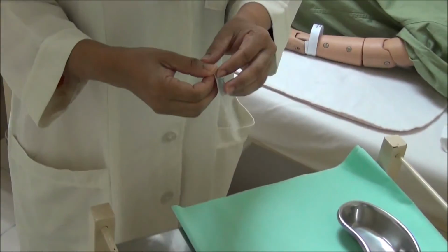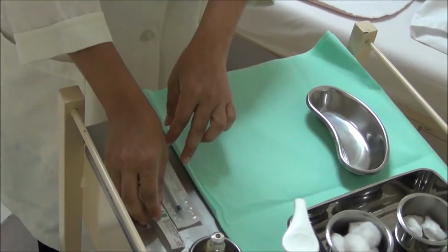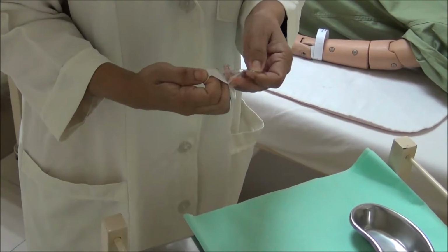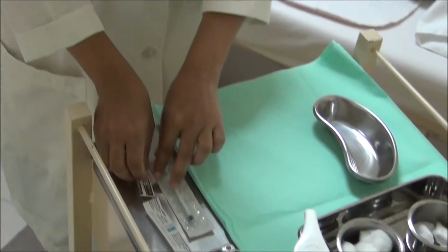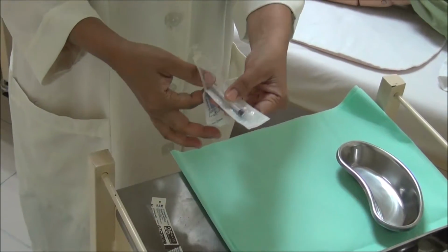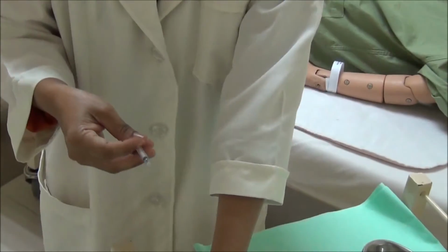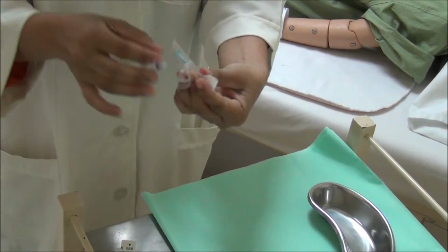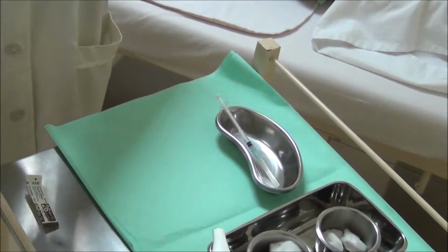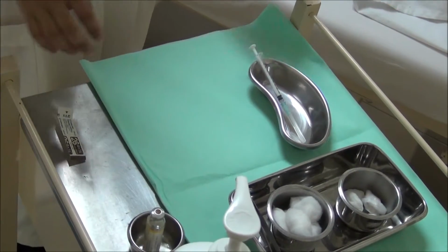So take the necessary syringe and needle, loosen the wrapper, remove the capsule from the top of the vial if it is a new vial, and do not touch the rubber part of the vial. Attach the needle and the syringe without contaminating the parts that I told you earlier.